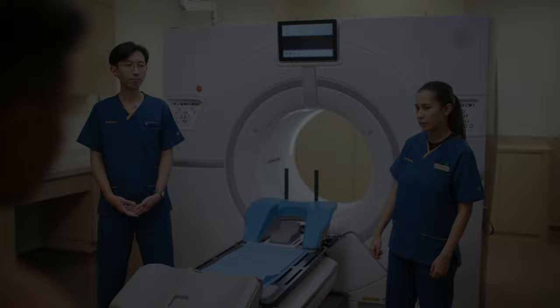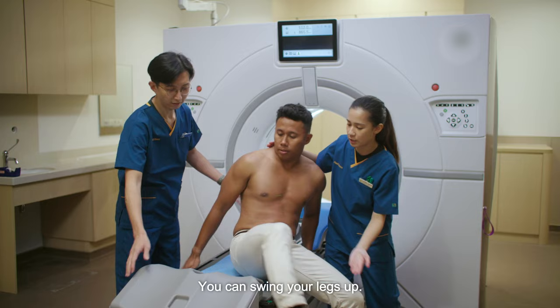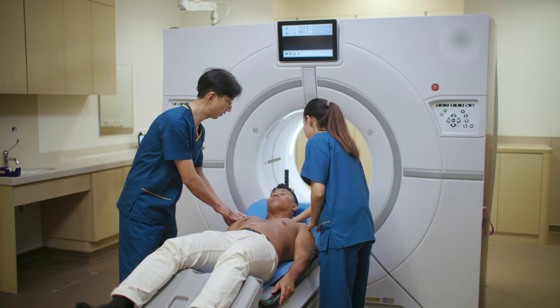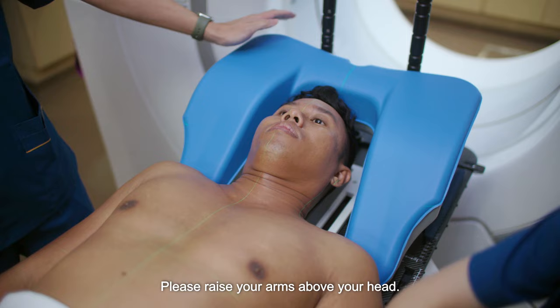Okay. You can come and have a seat over here. And you can swing your legs up. Okay, move your body down slightly. We're going to let you lie down slowly, okay? There's a pillow behind you. Yep, very good. Need your arms up above your head.